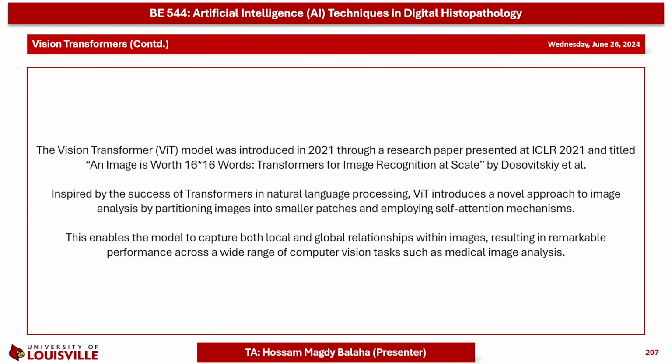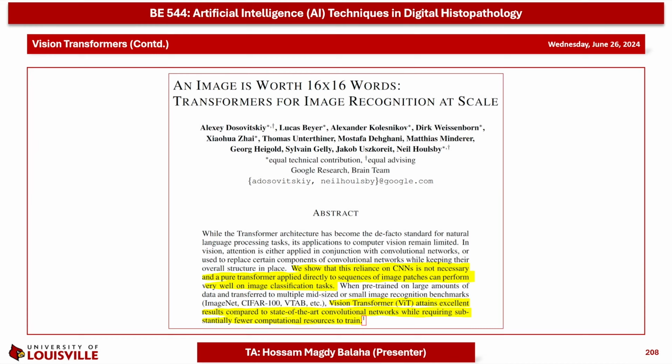Vision transformers can capture both local and global relationships within the image, and based on that, they became a remarkable approach in many tasks and fields such as medical image analysis. In their study, they noted in the abstract that the vision transformer attains excellent results compared to state-of-the-art CNNs while requiring fewer computational resources to train.